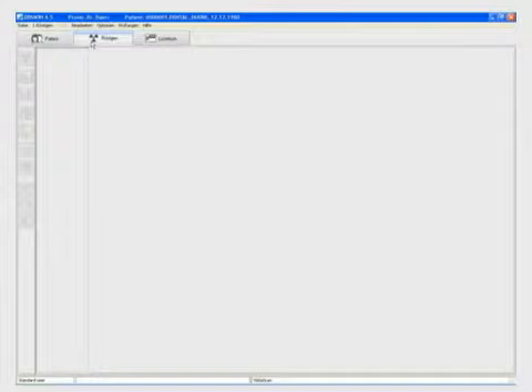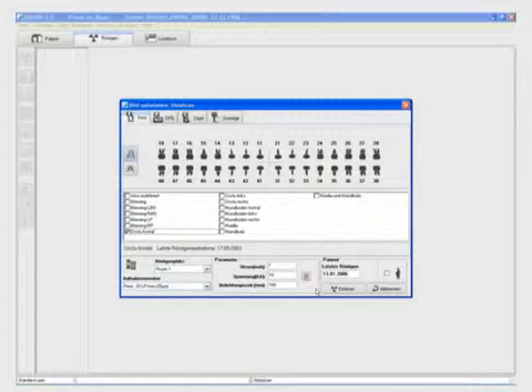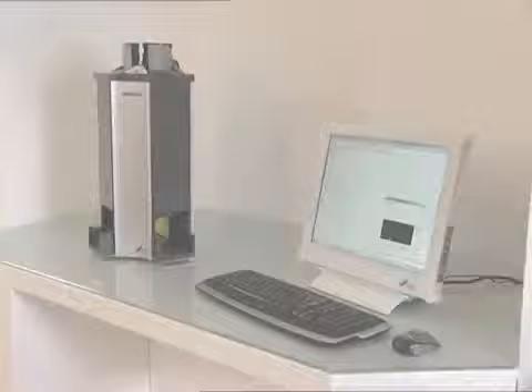No retraining is required while using image plates, as handling, positioning and choice of formats are the same as with analog film. The imaging software DBS Win enables the quick, efficient and safe use of the Vista Scan when scanning and saving the image.